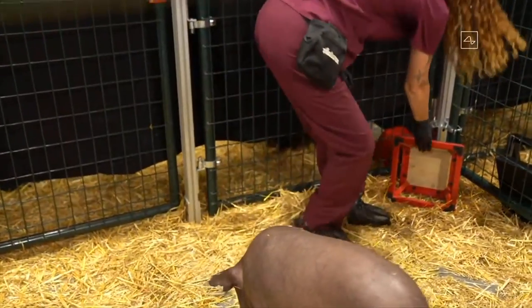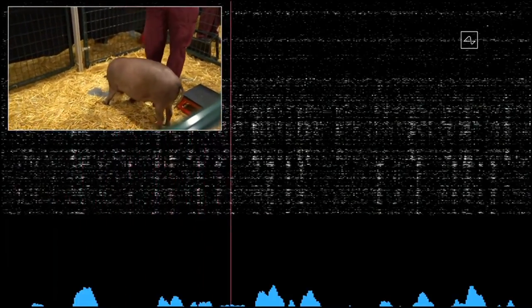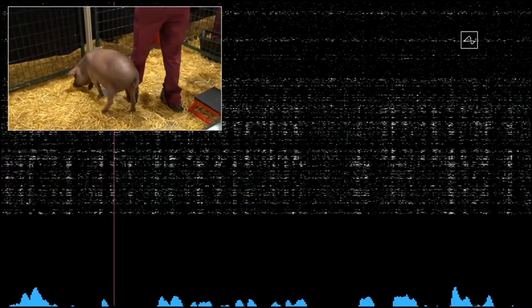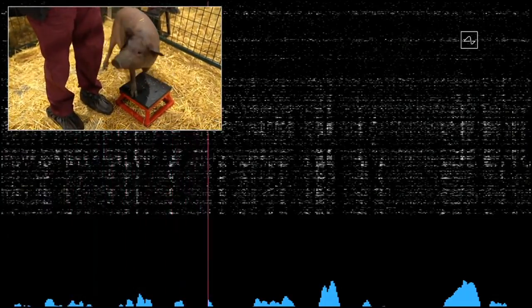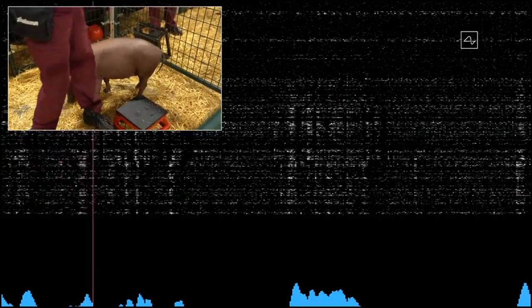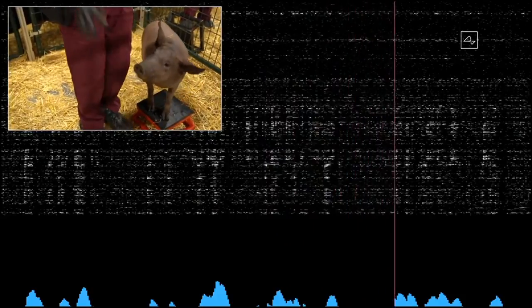Okay, this is a high energy pig. All right, Gertrude, thanks for coming out. The beeps you're hearing are real-time signals from the Neuralink in Gertrude's head. This Neuralink connects to neurons in her snout. Whenever she snuffles around and touches something with her snout, that sends out neural spikes, which are detected here. On the screen, you can see each of the spikes from the 1,024 electrodes. If she touches her snout to the ground, or you feed her some food, pigs love food, then you can see the neurons fire much more than when you're not touching the snout. And that's what's making the beeping sound.